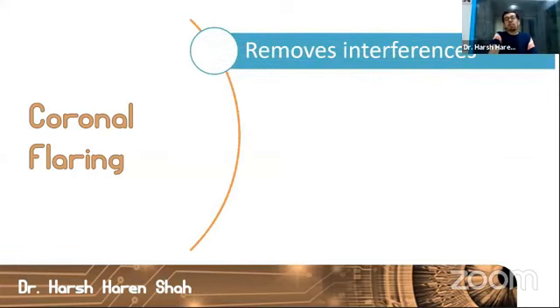The first is that it removes the interferences from the root canal system. If we talk about these interferences, sometimes what happens is there is a small shell of dentine that is covering the root canal orifice, probably partially. There may be a pulp stone in the pulp chamber which may pose as an interference. There may be certain aspects of the access opening which are not allowing straight line access.